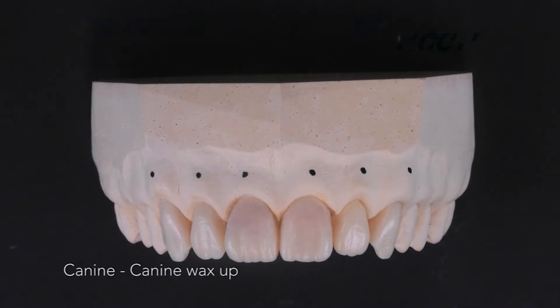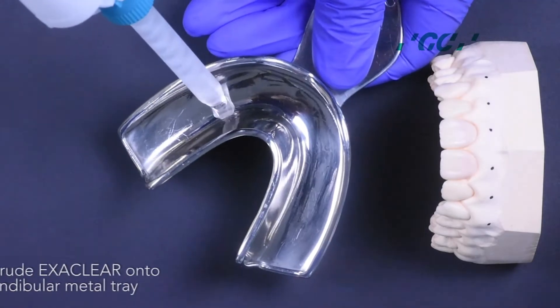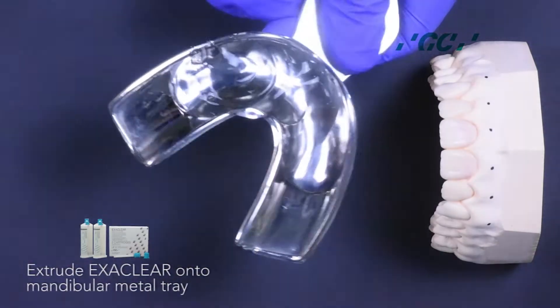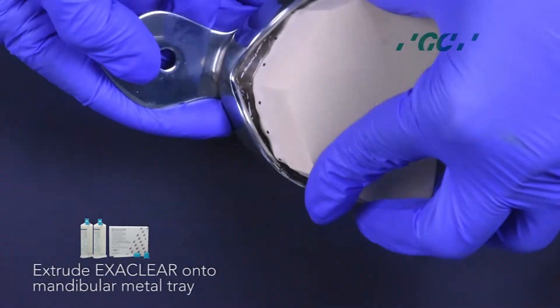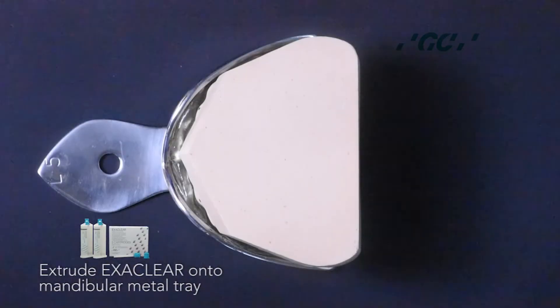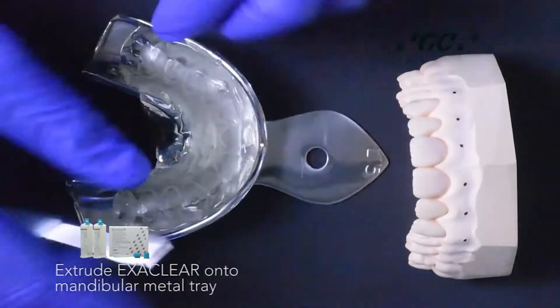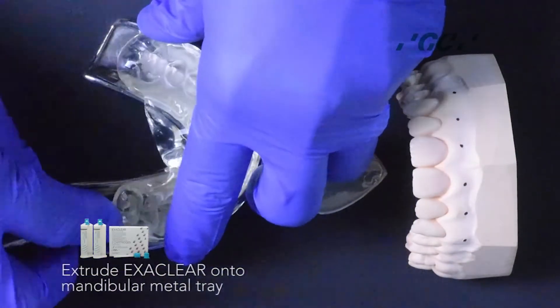Once done, extrude the Exaclear into the mandibular metal tray and take an impression of the waxed-up diagnostic model. Exaclear is a crystal clear vinyl polysiloxane material whose transparency offers total visual control and is ideally suited for the injection molding technique.